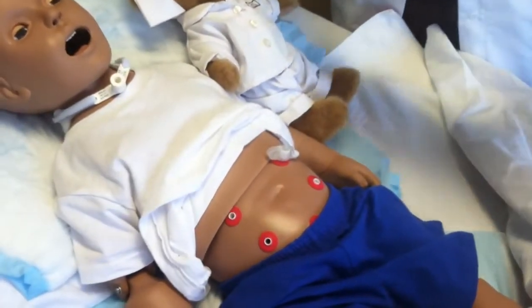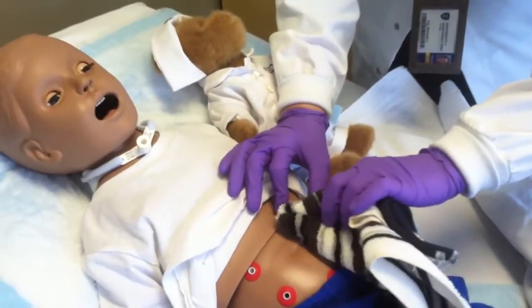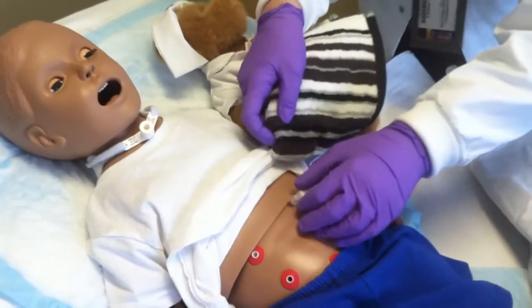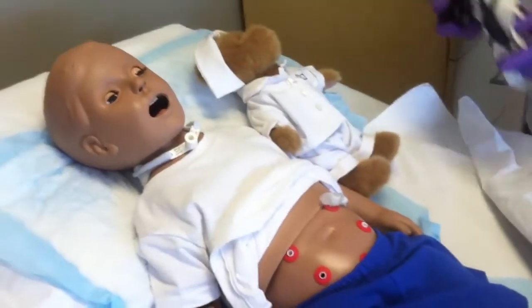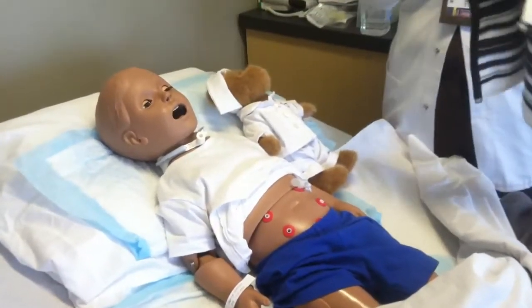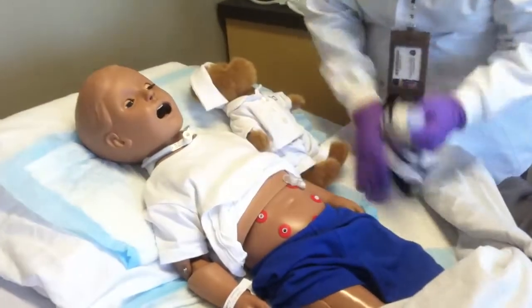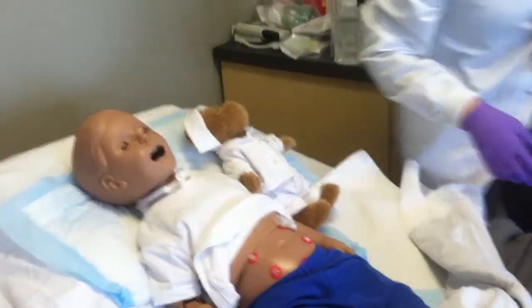And now we have to get that soap off. So on the clean, moist area of the washcloth, you're going to tilt up again and just clean that soap off and any dried drainage that you might see, and then tilt down and do the other side. Now we want to make sure it's going to be very, very dry before we're done. I left part of this washcloth dry, so I can just use the same washcloth to dry the site. And that's how you do GTube Care with a washcloth.